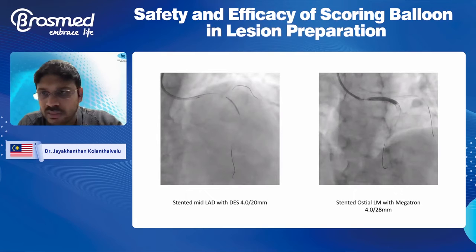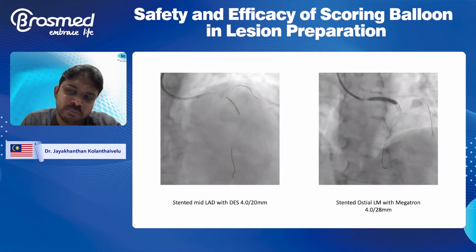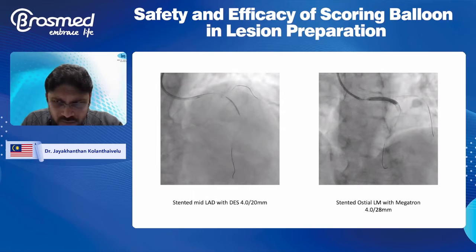In fact, there's one small thing missing here: we pre-dilated the left main lesion with a 4.0 Wedge, which I missed putting in. We actually did that, and the last image I showed you was after that. So we felt that we'd achieve good stent expansion and a good MSA. We put in a 4.0 by 20 in the mid to proximal LAD and a 4.0 Megatron, because I wanted to stretch the stent adequately in the left main. And I managed to do just that.